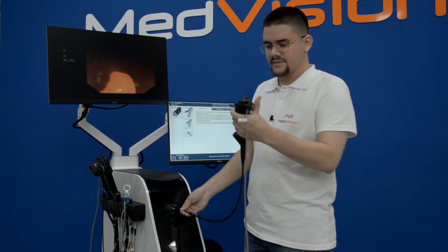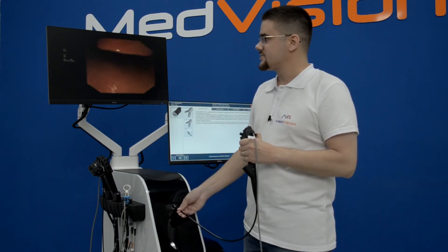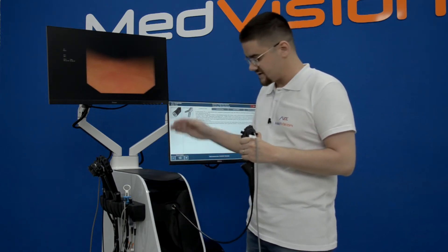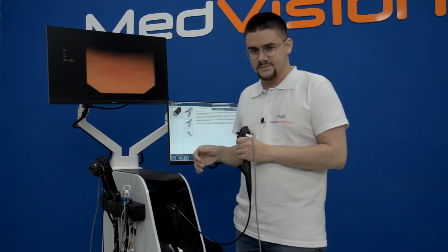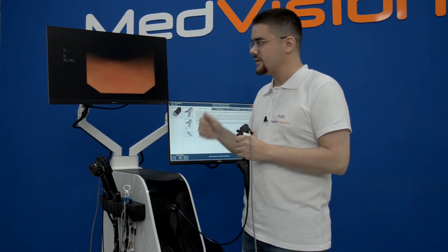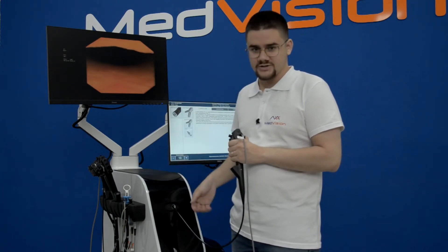Everything here will be familiar. What we would like to highlight is the feedback system — as with all of our surgical simulators, we have a very realistic feedback system that gives you real-time realistic responses to your actions.